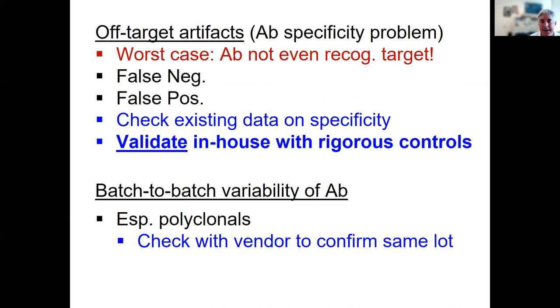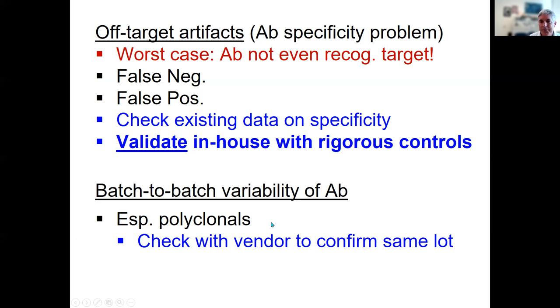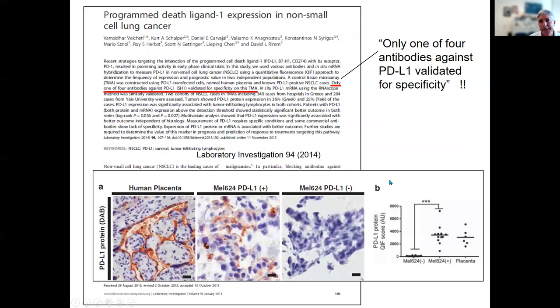There is also batch-to-batch variability: you may have a validated antibody that works fantastically, then run out and order another lot — and it doesn't work the same way. This is especially a problem for polyclonals, since they are made in animals and when the stocks of a particular lot run out, a new animal must be immunized. The antibodies generated in that new animal are not necessarily going to behave the same way. If consistency matters, check that the vendor can supply the same lot, or stock up on it upfront.